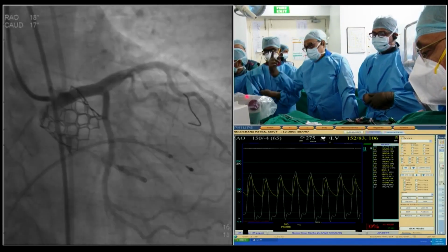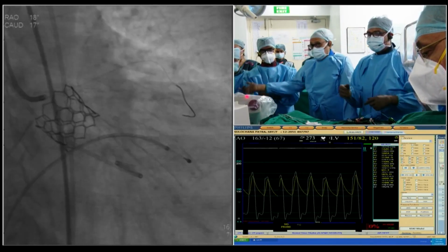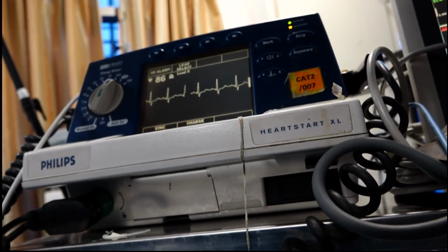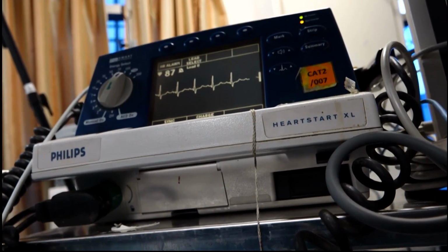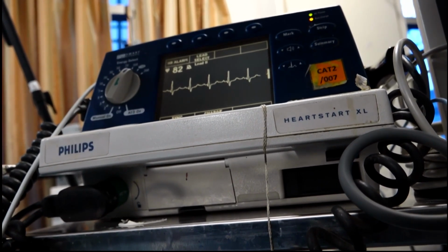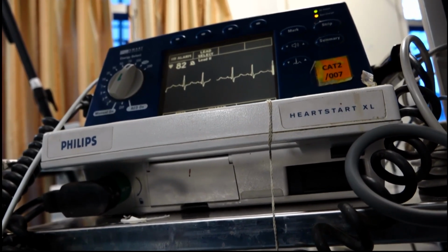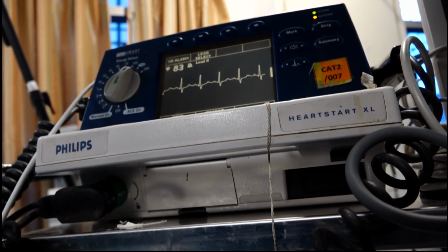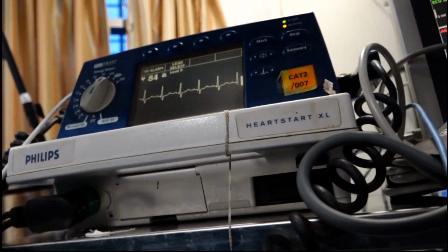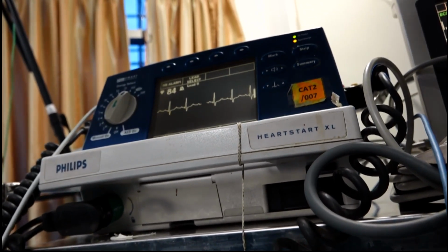Go back. LAO. Now there is no staining there. Earlier in the LAO view, there was some staining. Here's the coronary leaflet angio. Can we repeat it and see? Because now it's very clear. The RAO view looks very clear. So there is a suggestion that maybe you could do another injection in a caudocranial view. Anil, is it a good idea to pull the wire, just keep the soft portion there?